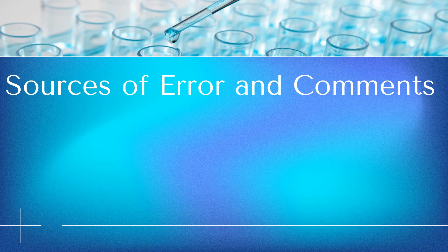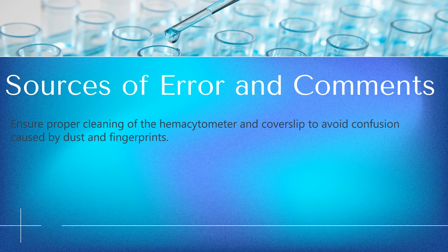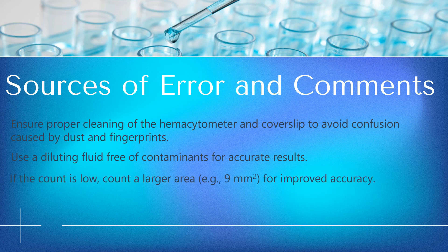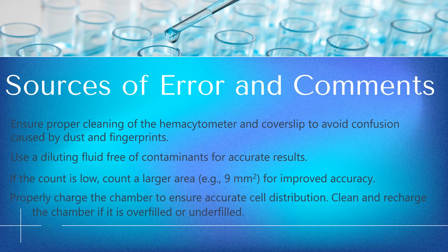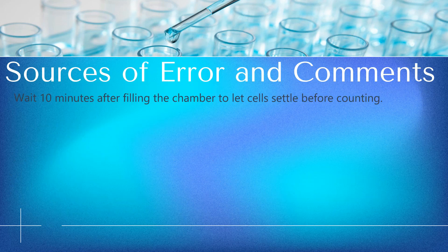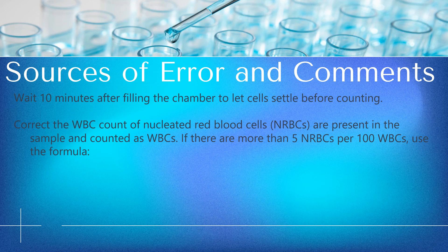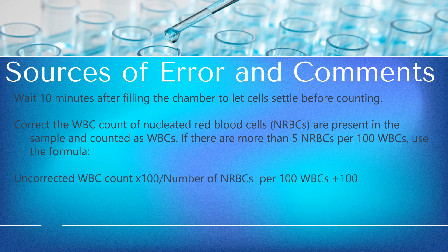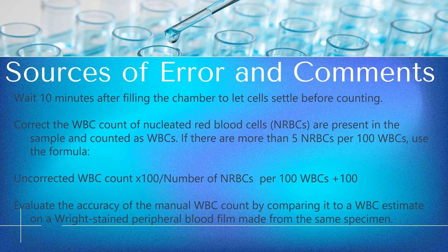Sources of Error: Ensure proper cleaning of the hemocytometer and coverslip to avoid confusion from dust and fingerprints. Use a diluting fluid free of contaminants. If the count is low, count a larger area for improved accuracy. Properly charge the chamber and clean and recharge if overfilled or underfilled. Wait 10 minutes after filling for cells to settle. Correct the WBC count if nucleated red blood cells (NRBCs) are present; if there are more than 5 NRBCs per 100 WBCs, use the formula: uncorrected WBC count × 100 ÷ (NRBCs per 100 WBCs + 100). Evaluate accuracy by comparing to a WBC estimate on a Wright-stained peripheral blood film.